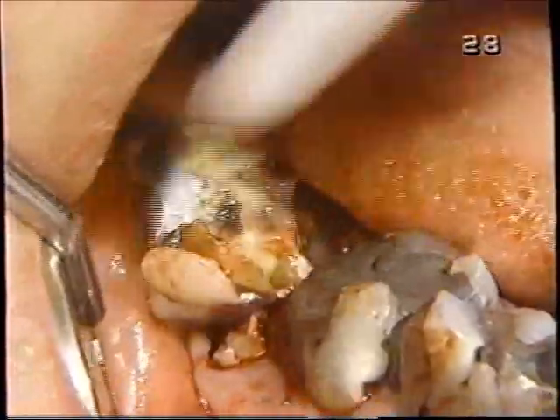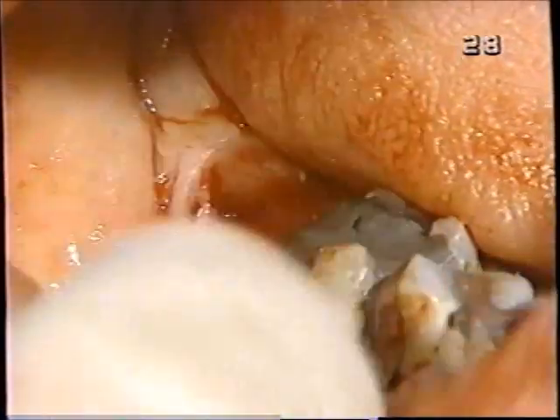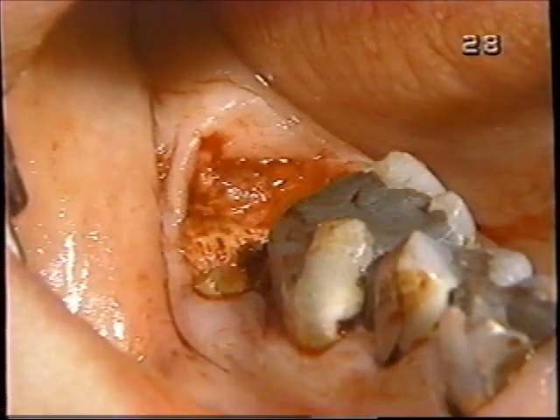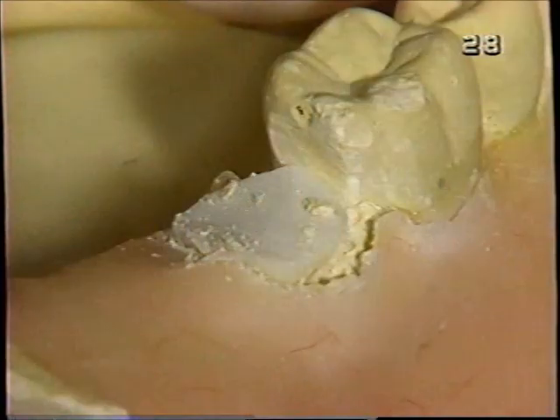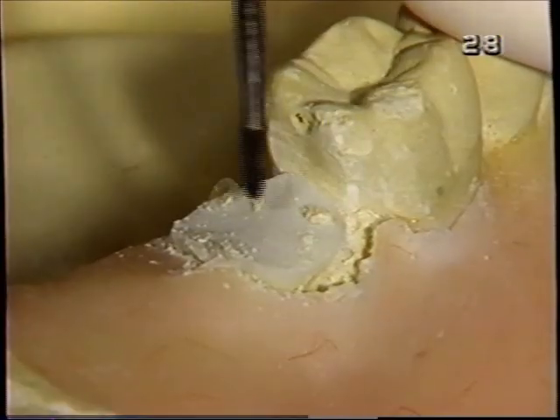That happens. And when it does, you just have to deal with it. The tooth is weak. We were using luxation forces, but still the tooth fractured off, kind of between the gum line and the bone level. Actually, on the distal, it's quite a bit below the bone level. What we need to do here is not continue luxating. We've already done that. We need to divide and conquer. We need to separate those roots. It's futile to continue doing anything with them intact that way.